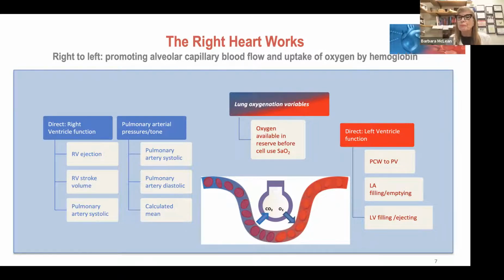Okay. So we're going to use pulmonary capillary wedge pressure. That's what we talk about, or PA diastolic pressure. And that's what that was, really should have been PAD. I kind of wrote this little term right before we got on. I might not have saved it or did a little something wrong, but wedge pressure and PAD.